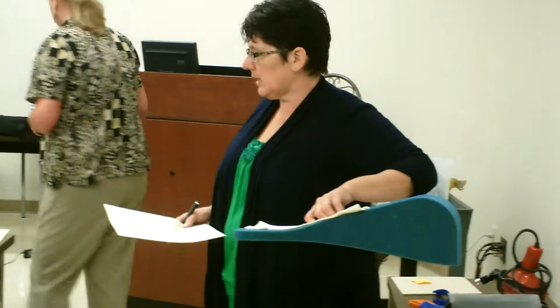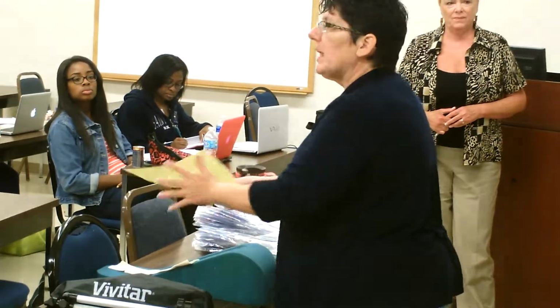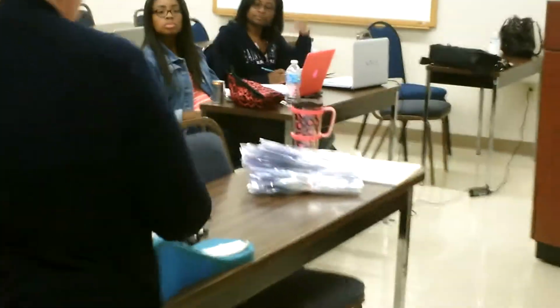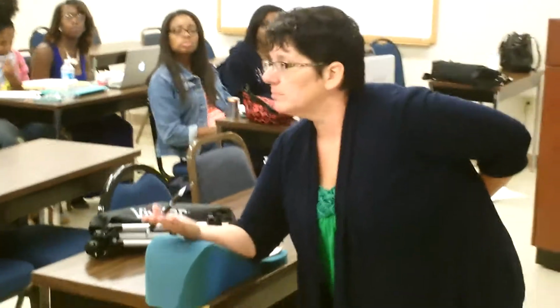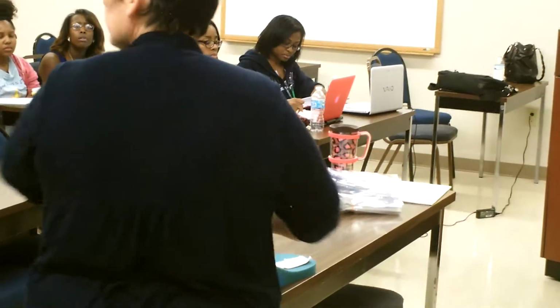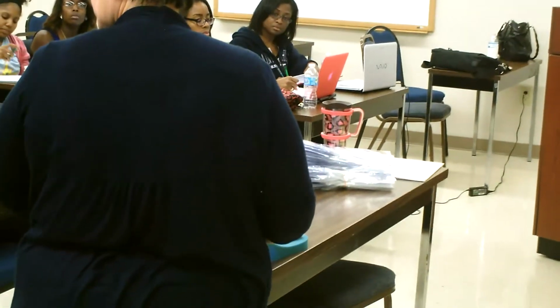So, first of all, I always want you to position the person in a way that you can get to their body. If the person is here, that's okay, because you're right on. You want to be head on to the patient. If the patient is like this, and they're in the middle of the table, you're going to be like this, which is bad biomechanics. So always position the person. This is meant for their arm, and you're going to have their arm turned upward like this, okay? So position the person optimally so their arm is at the edge of the table, okay? Does that make sense? So that's going to be important. And I'm going to yell at you about that one too. I'll be nice, but I'm sort of preemptively telling you.